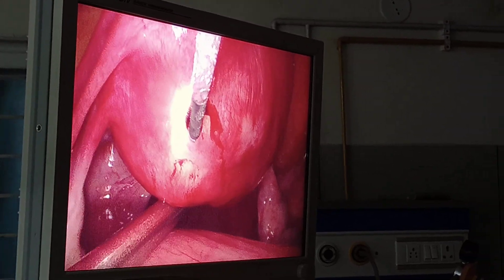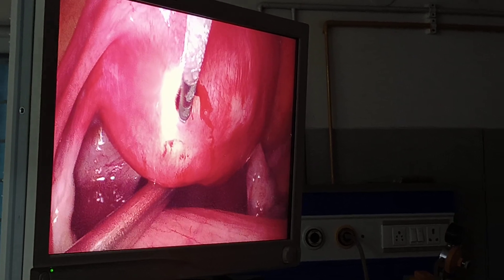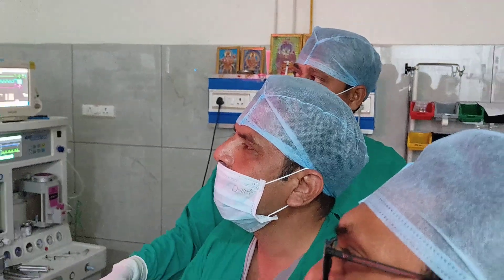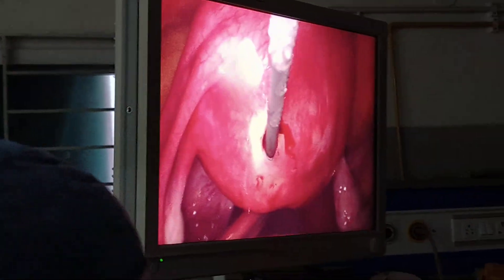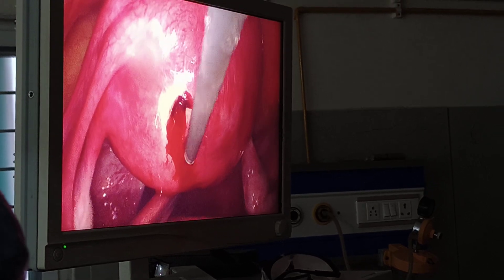When I am coming out, you can see the white blanching surrounding our penetration entry point. Once you see — now bleeding will cease. There is bleeding now, you can see there is bleeding. So it is partially ablated.